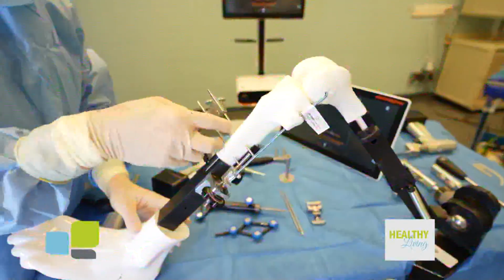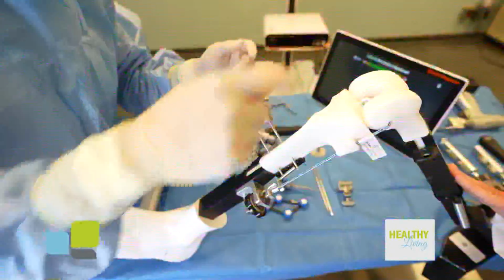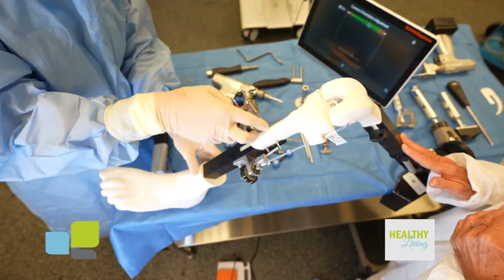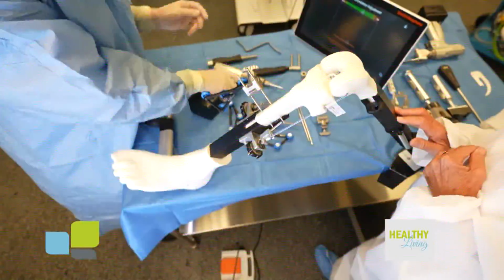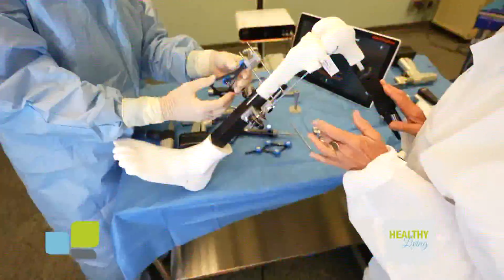So I already have, on this sawbones model, 2 of my trackers put in. During live surgery, what will happen is an incision will be made. The knee joint will be exposed. And then I will, through separate tiny stab incisions, put pins temporarily in the bone, below the knee and above the knee. And I'll demonstrate the above the knee pins right now. And the purpose of those? The purpose of those pins is to hold this array.